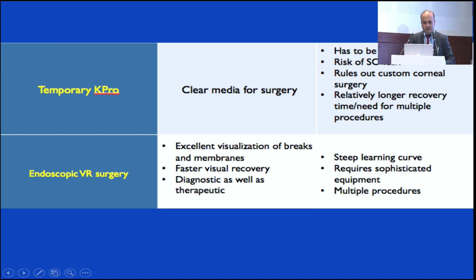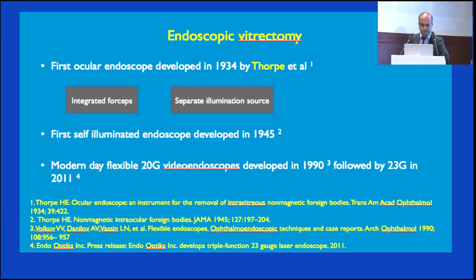Endoscopy allows us to obviate these problems and get away without using a temporary keratoprosthesis. It gives us an opportunity for better visualization of breaks and membranes, and can be diagnostic as well as therapeutic. The problem is that it comes with a bit of a learning curve, but that can usually be overcome. So let me just show you a few examples.